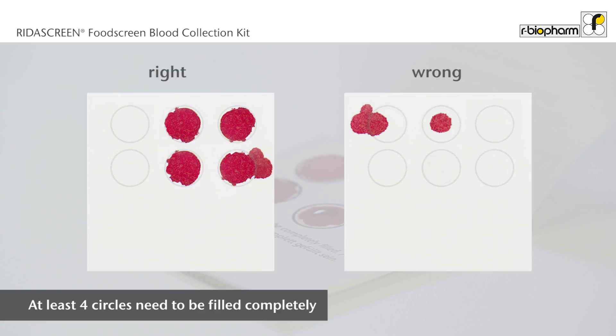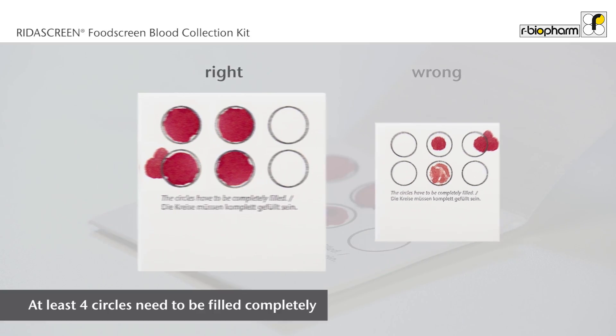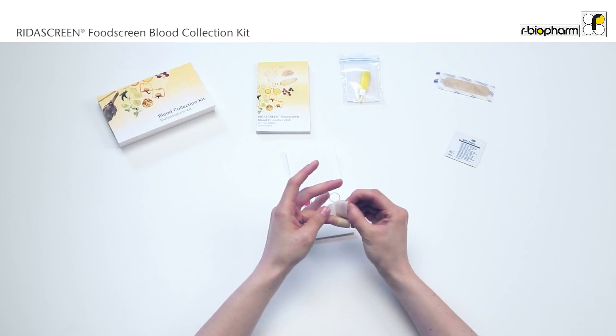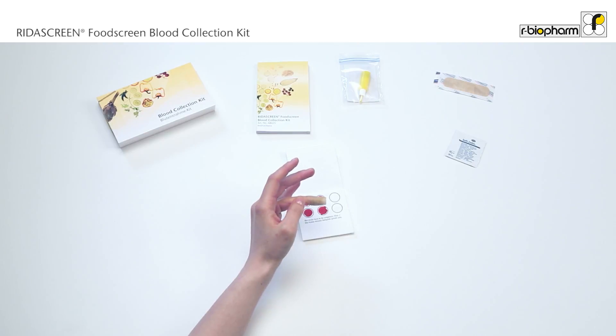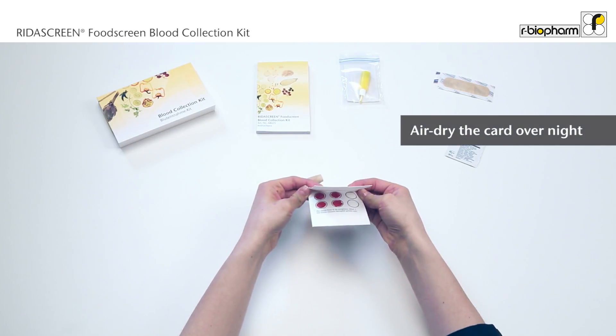Check that the circles are filled correctly. It is crucial that the backside of the circles are soaked throughout with blood. Please note that incorrectly filled blood circles cannot be used for the analysis. Patch your finger with the provided bandage and let the card air dry overnight at room temperature.